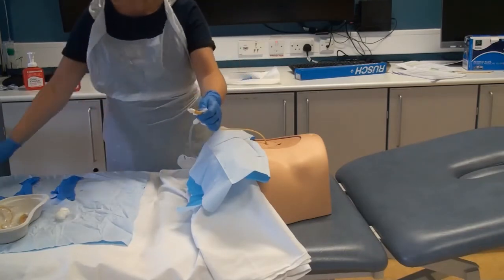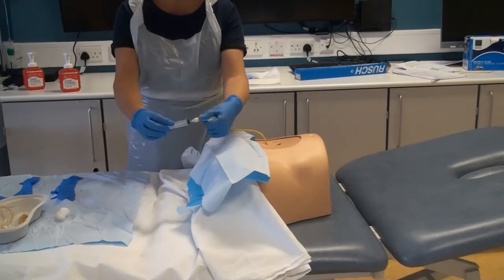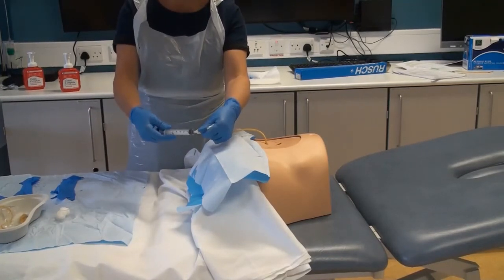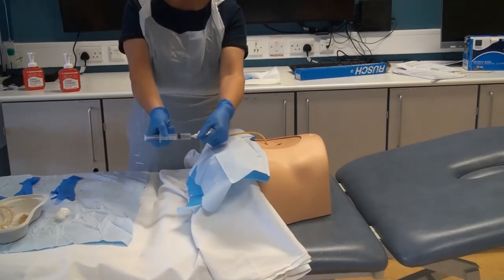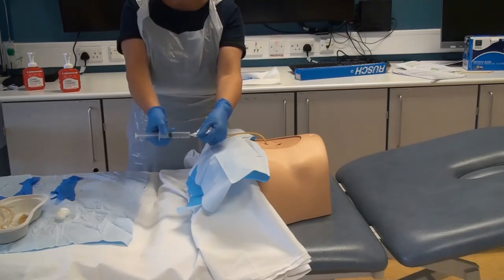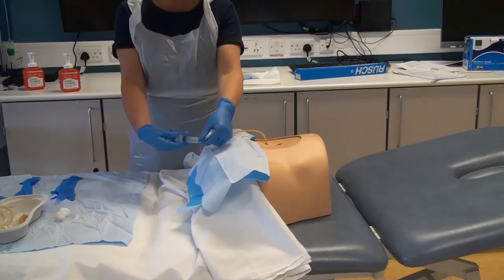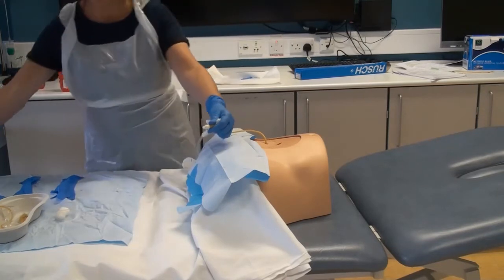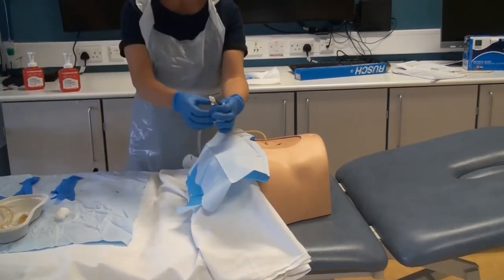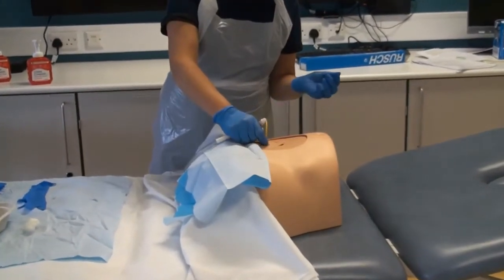Attach a syringe to the catheter balloon inflation valve and deflate the catheter balloon. Note the volume removed and allow the water to come back spontaneously.